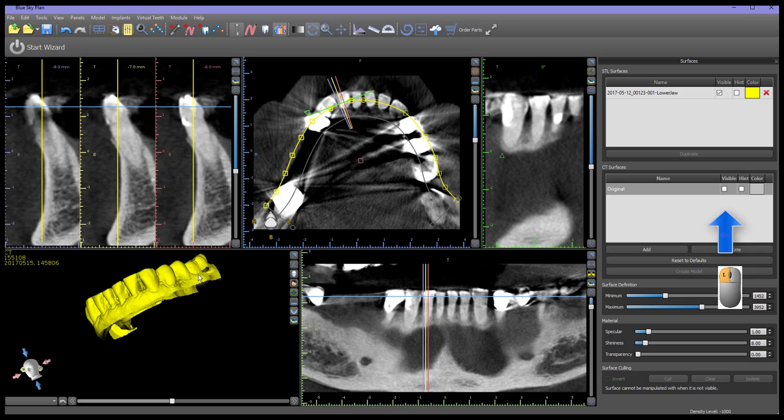If the model is hollow or does not have a sealed base, it should be closed before extracting teeth. The Close Model function is found in the Model Manipulation panel.